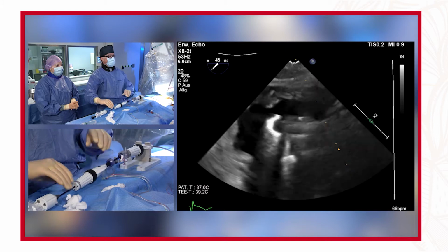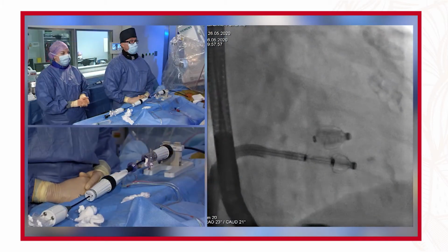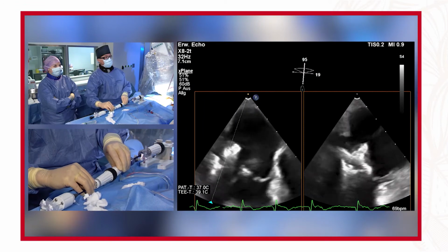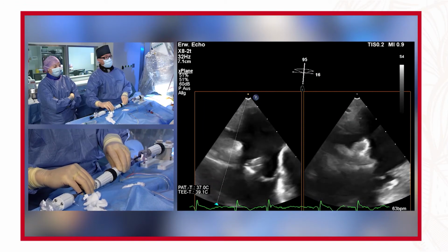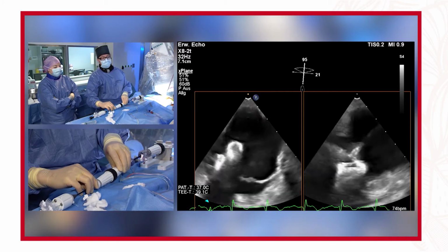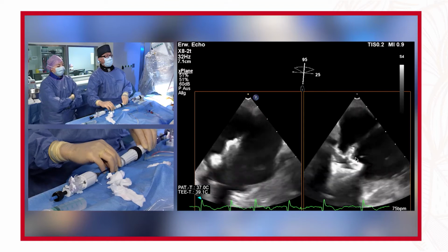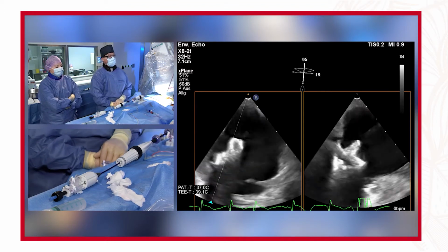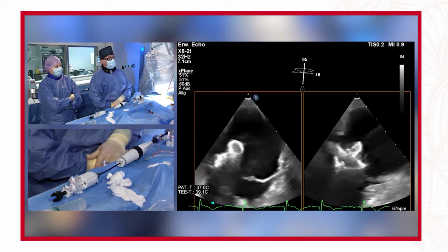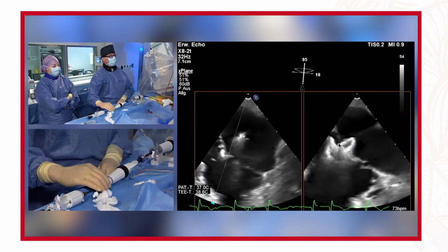When we're in this location, the system has been opened again very, very slowly. Now you see also by fluoroscopy that we're just beneath the leaflets. A good echocardiographic window in this mid-esophageal view is being looked for. You see that now the posterior leaflet is falling nicely on the posterior arm. The clasp has been pulled down so that we have a nice leaflet insertion of this posterior leaflet in the PASCAL system. The septal leaflet is already bouncing on the septal arm.